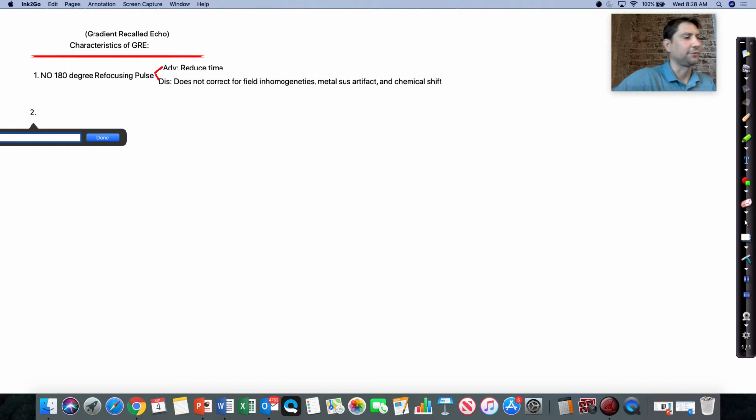Our second characteristic, we don't have to wait for dephasing and rephasing.